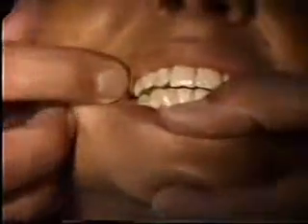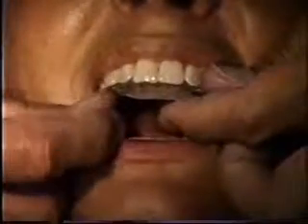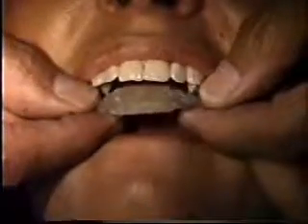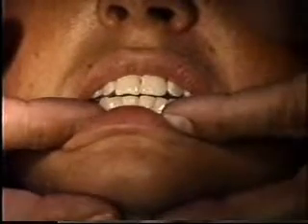We have discussed the possibility of putting build-ups in, but at this point it is not a viable alternative. So we are going to add a build-up in each of the bicuspid areas on the splint, which has already been reinforced with little metal attachments here, and then cut out the palate. We will have her biting only on these bicuspid areas because we feel she needs to wear the bite splint all the time, and because of the large area and the incline in the front, it restricts the talking.